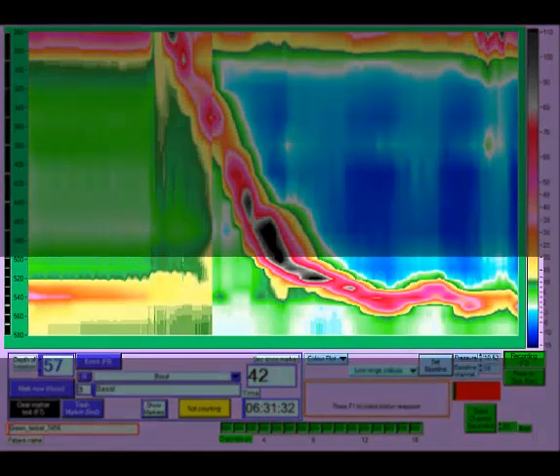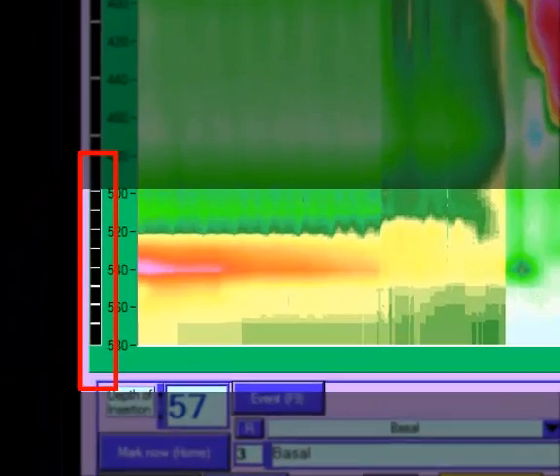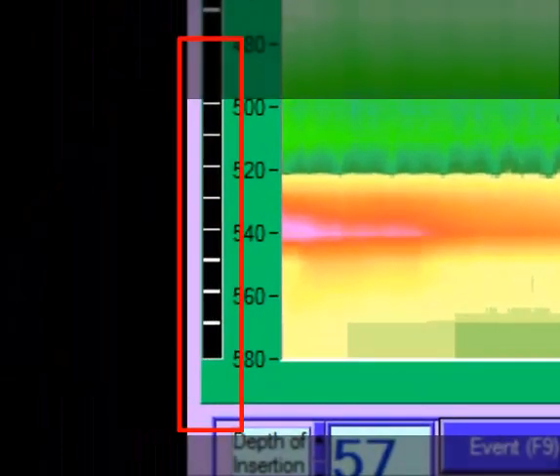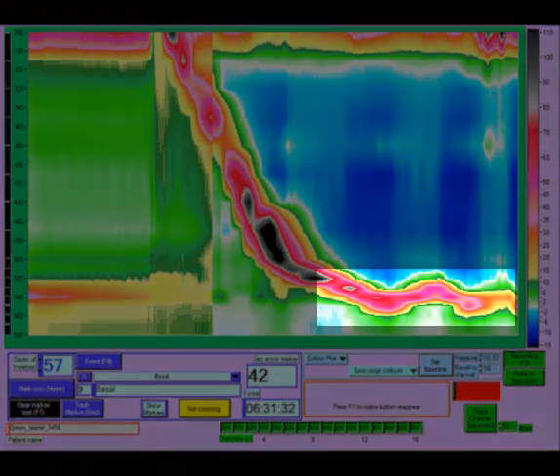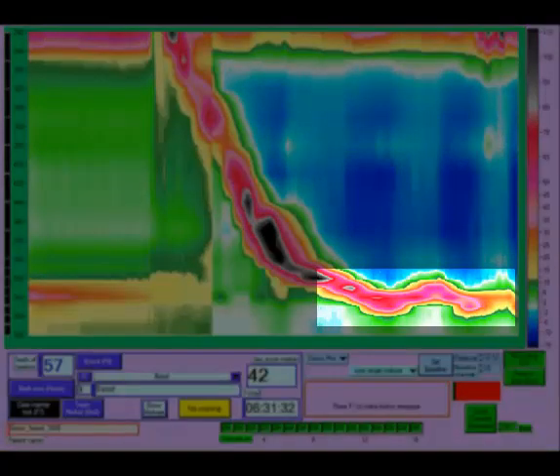The most important factor in positioning the catheter is that the lower esophageal sphincter is within the high resolution area of the catheter. If the lower sphincter is difficult to see, ask the patient to swallow, which will cause a post-swallow augmentation of the sphincter pressure.